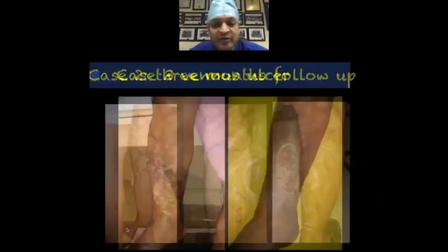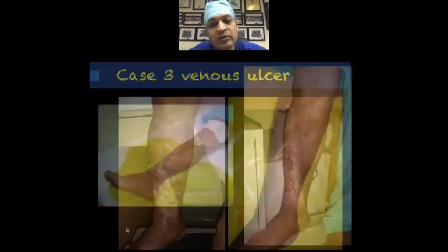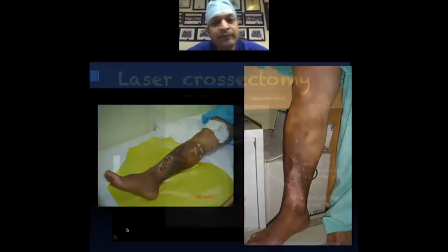Similarly, venous ulcer, you can keep on putting these pictures, but that's not important. Now, important over here is give antibiotics, take a culture, put in a 4-layer compression bandage, and once the ulcer starts looking good, you can do a laser under local anesthesia, and you can take a skin island from the top. And these days you can also use an artificial skin on such a small wound and get these ulcers healed.